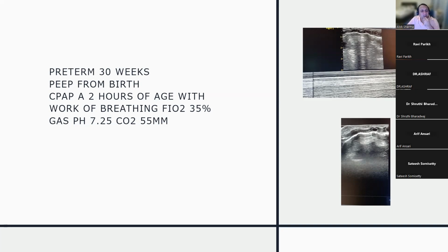And back to clinical correlation, Alok. Satish here. You said although babies in about 35% oxygen with CO2 retention, I think the question we need to address is, if I remember correctly, there is significant work of breathing. Yep. And the baby is already on PEEP of 7 with significant work of breathing. Yes, excellent. We have detected small anterior pneumothorax in R1. Rest of the zones, it doesn't classically fulfill the criteria for significant surfactant deficiency based on the information so far. Yep.